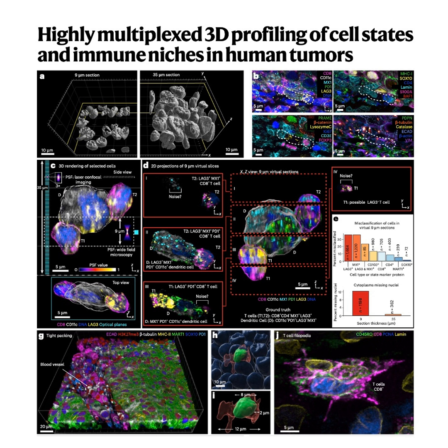Amazing. I also recall reading in the paper that 3D imaging corrected a major misconception about cell shape, and it turned out to be just a matter of perspective, of geometry. Yes, that was a fascinating example in melanoma. Based on 2D images of melanoma invading the skin, specifically vertical growth phase or VGP melanoma, researchers had previously concluded that the cancer cells fundamentally changed their shape.